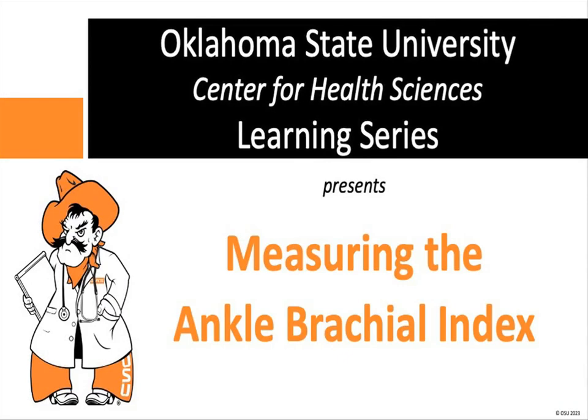Welcome to the Oklahoma State University College of Osteopathic Medicine training video on the Ankle Brachial Index, the ABI, otherwise known as the Ankle Brachial Pressure Index, the ABPI. The ABI is utilized in the diagnosis and monitoring of peripheral artery disease, a disease that impacts about 8 million people in the United States, though unfortunately only about 30% have been screened and diagnosed.